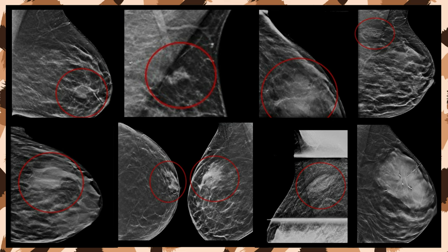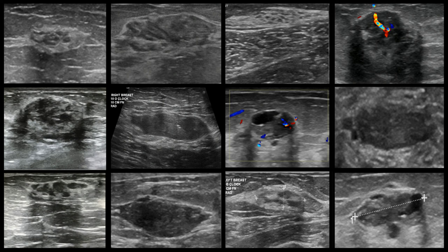Unless it looks distinctly like a mass on ultrasound, it can be really hard to locate and very easy to scan past and miss. The reason this video is titled 'The Many Faces of PASH' is because of this slide — showing all the various presentations of PASH seen over the years. There's a highly variable appearance, from a hypoechoic mass that looks more like a fibroadenoma, all the way to just a patch of benign-appearing glandular tissue, though the most consistent appearance is tissue that looks subtly different.